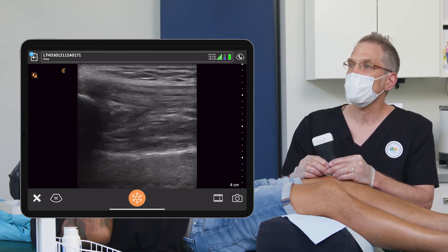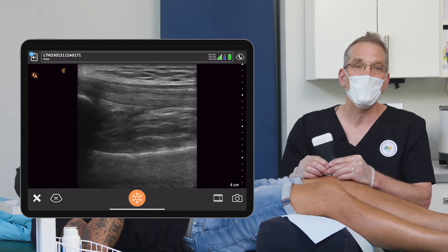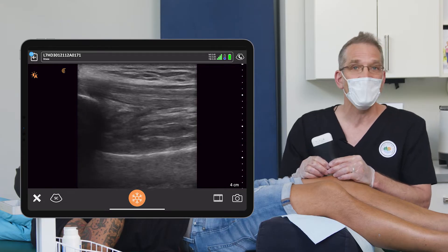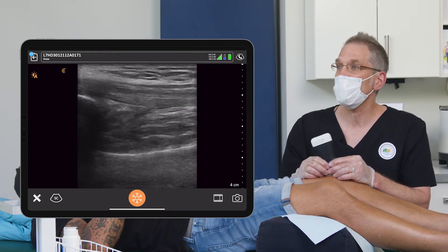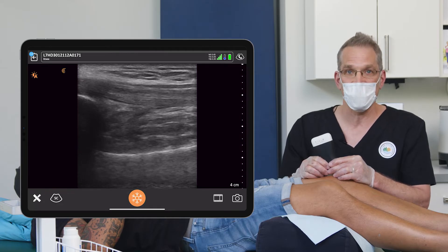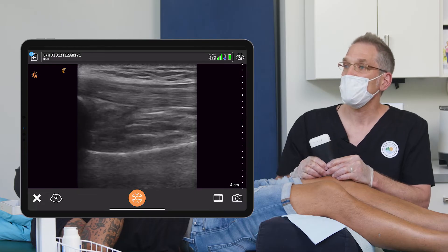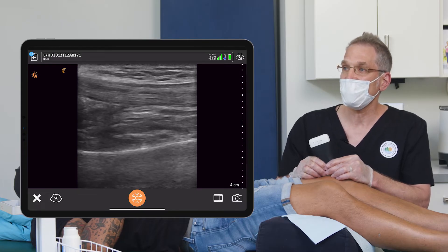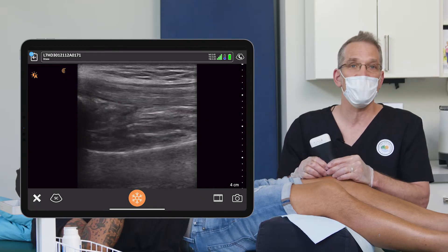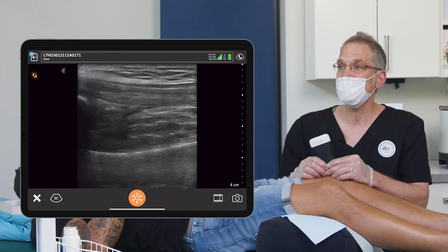As part of the exam, the first thing we do anytime we're looking at a knee injection is scan for how much fluid is in the knee joint. In Rico's case, the knee does not have much fluid. If there were a large fluid pocket, we would see a large black hypoechoic space just deep to the quadriceps tendon. In some cases, that pocket can be very large and filled with up to 100–180 cc's of fluid.